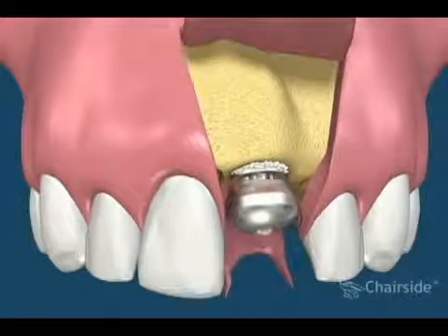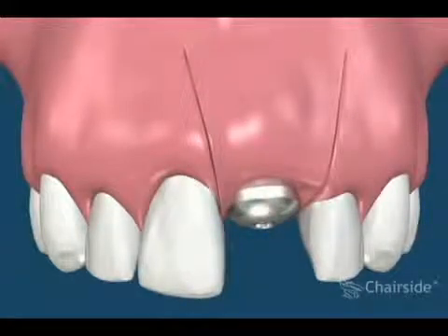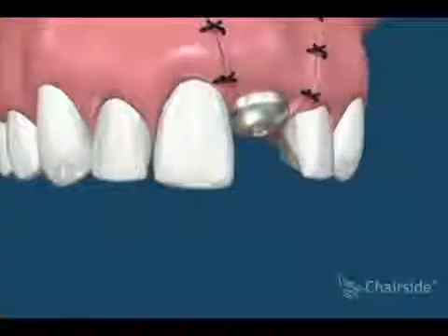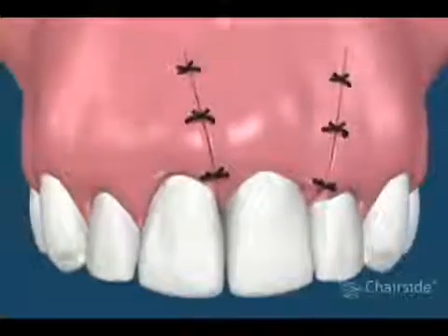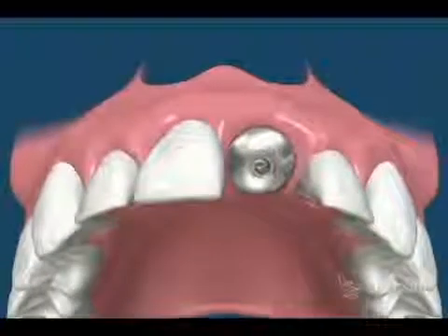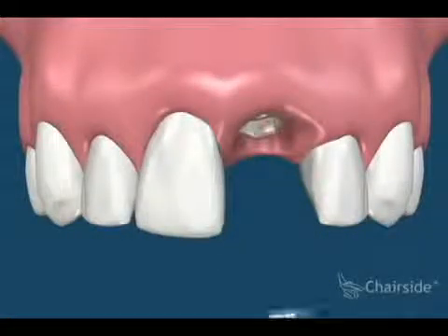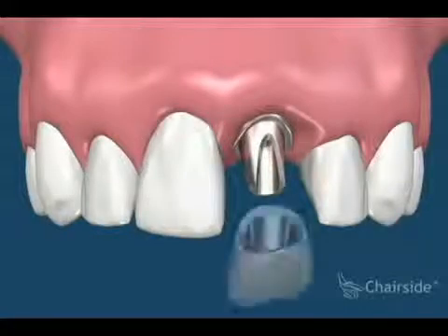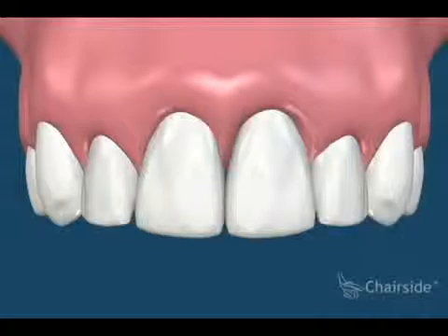The implant is covered with a healing cap. The gums are repositioned and sutured into place. A provisional denture can be used as a temporary tooth replacement. The sutures are removed or they will resorb. The healing cap helps the gums heal and allows access to the implant fixture for restoration. After the healing period, the healing cap is replaced with an abutment and crown.